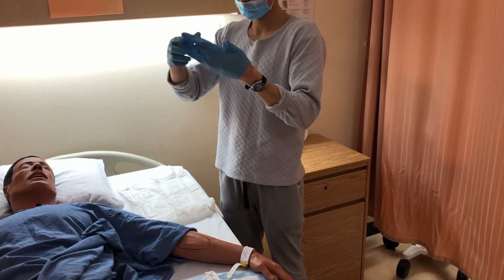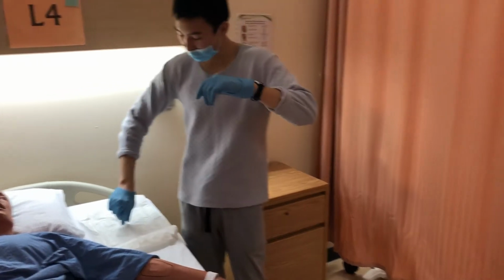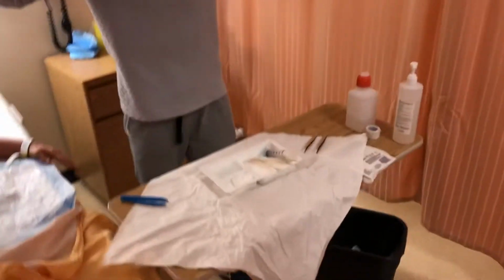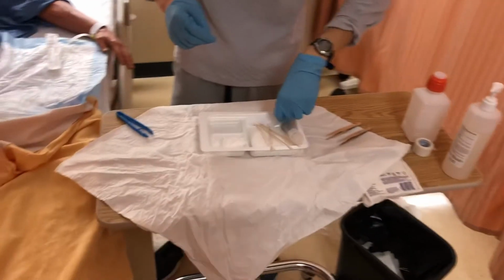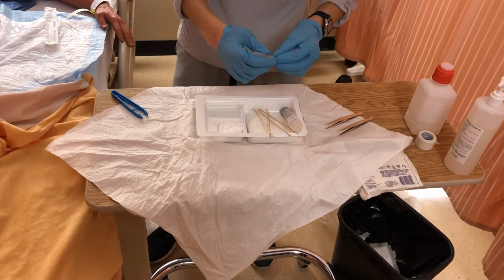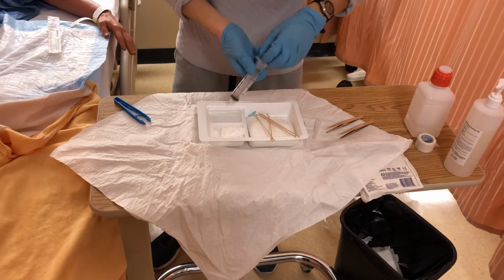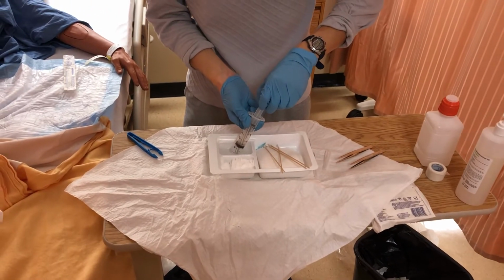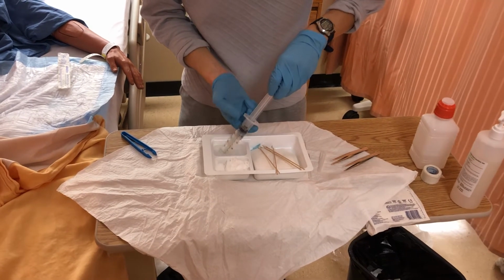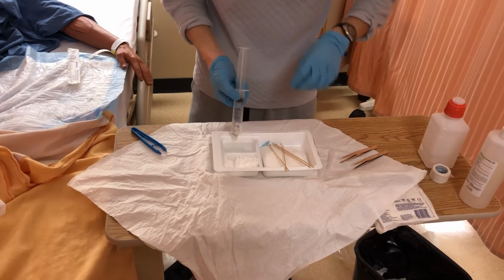So now I'm going to check the dressing. And now I have my sterile gloves on. I'm going to touch the middle of this. Sterile on sterile is still sterile. And now I'm going to get my IV Cathlon out. There it is. And now I will fill this up with 30 ml of normal saline. And now I'm going to thread on my Cathlon.